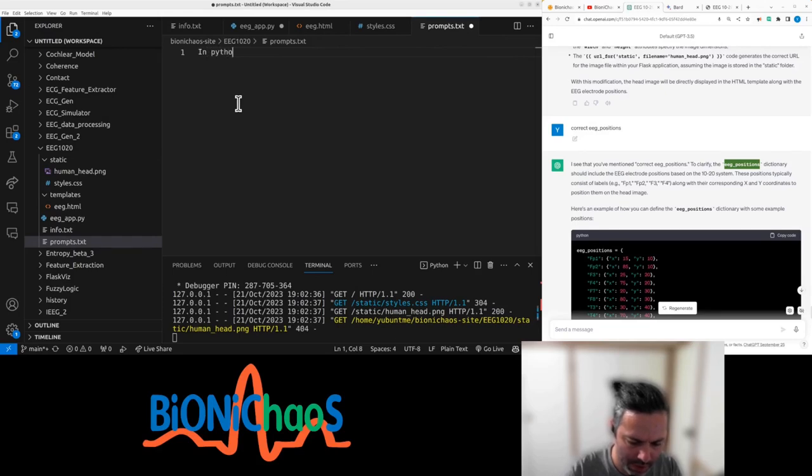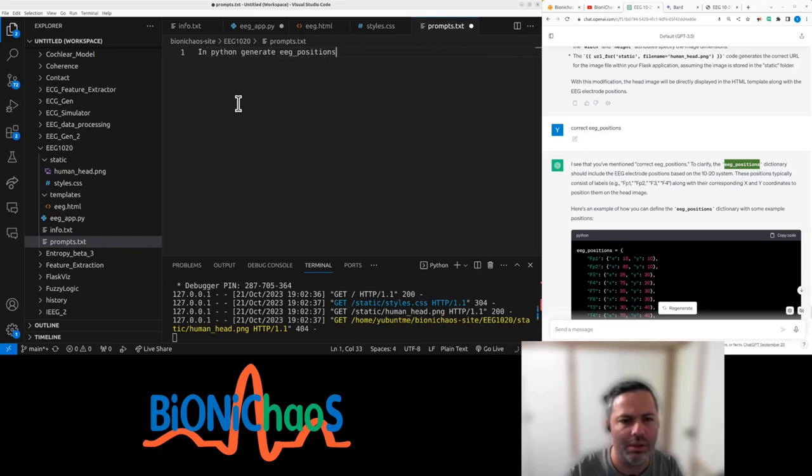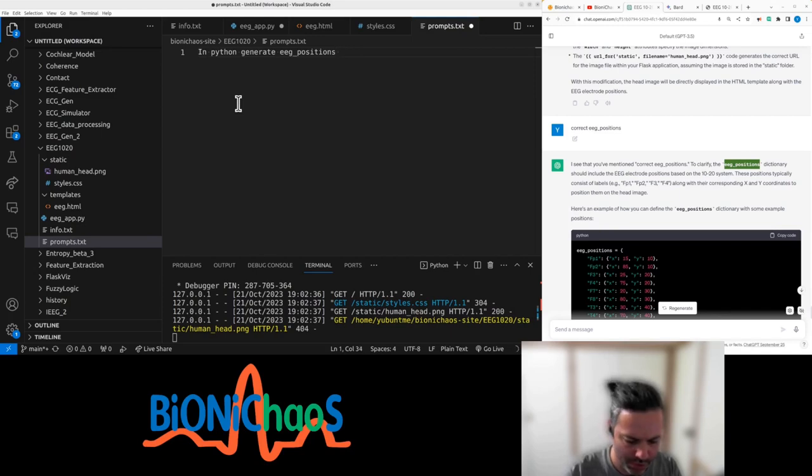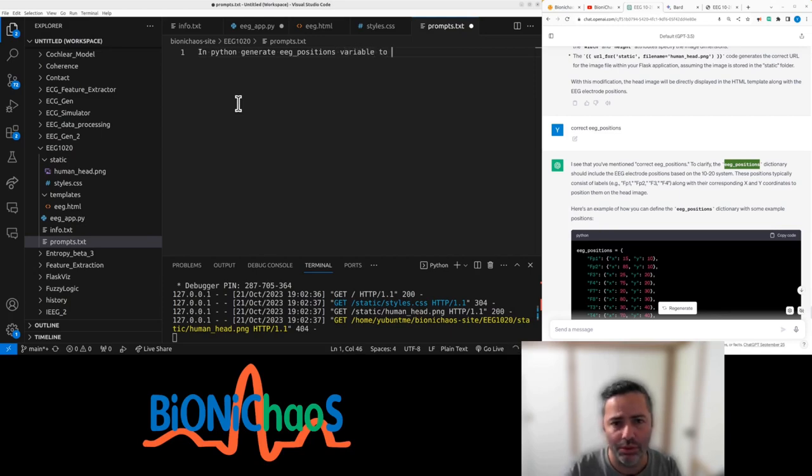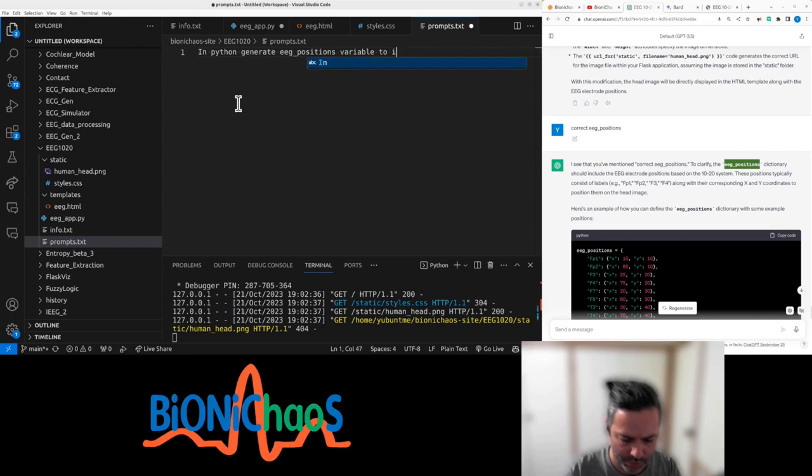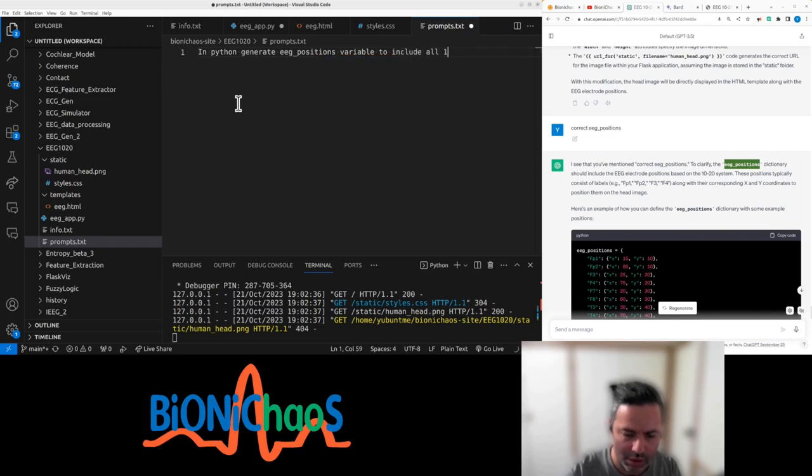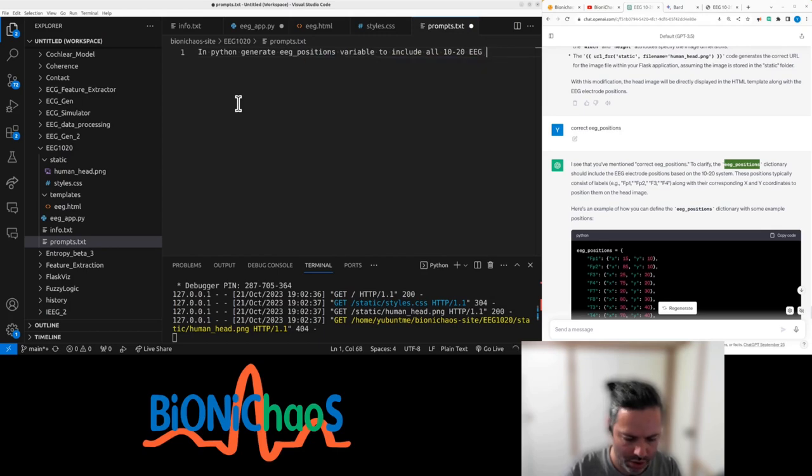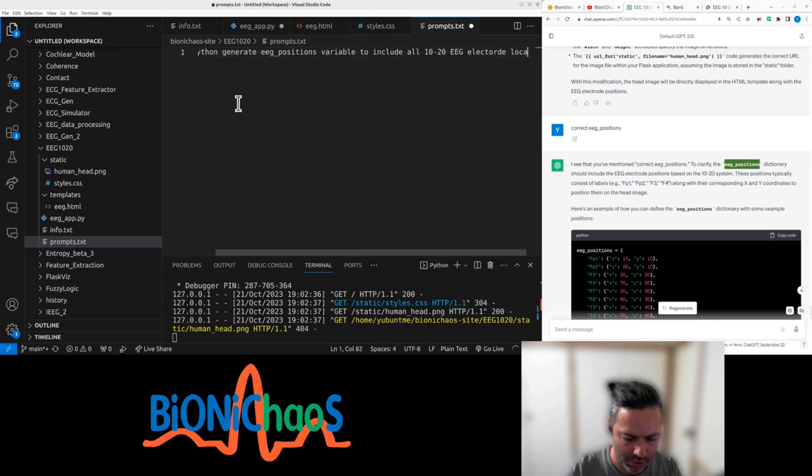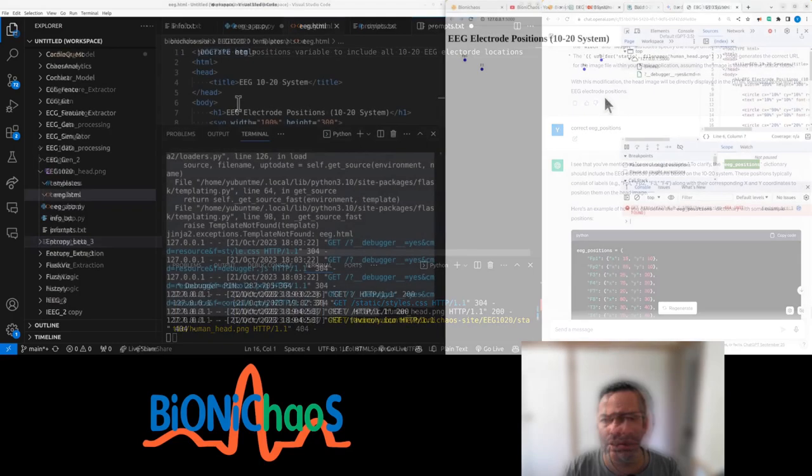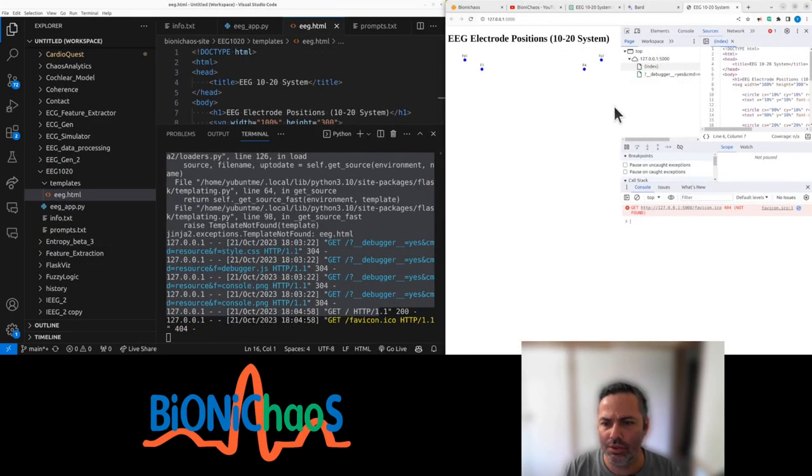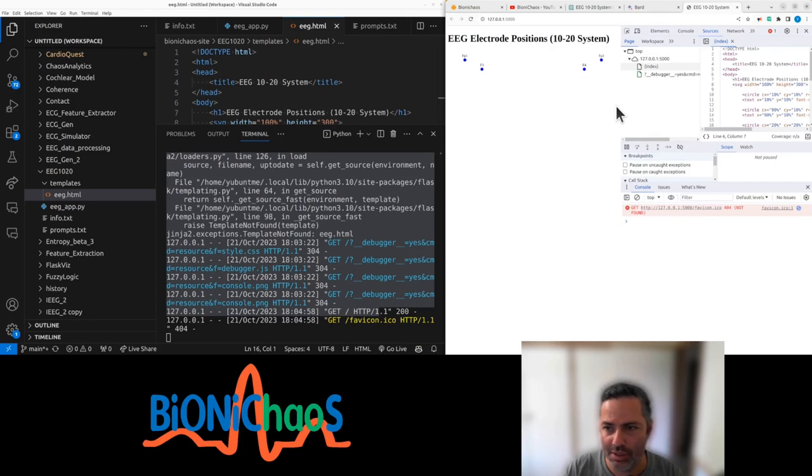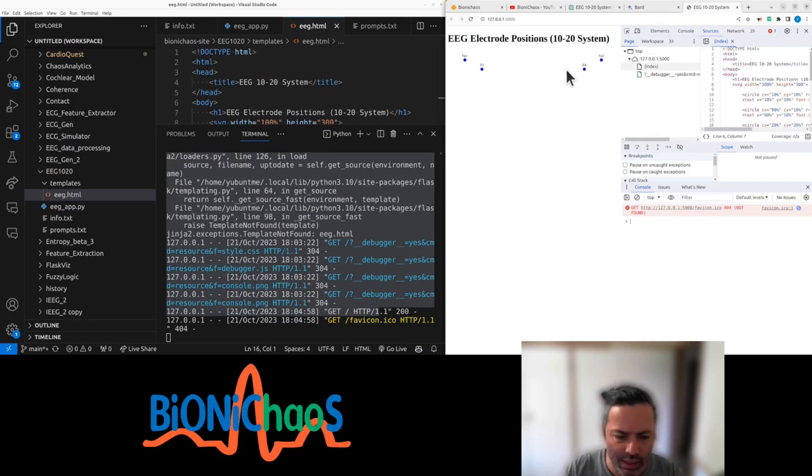In Python, generate position variable to include all 1020 EEG electrode locations. Right, control five, and we have an electrode position 1020 system. That was pretty quick. Probably want to overlay it.